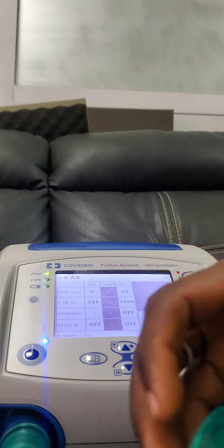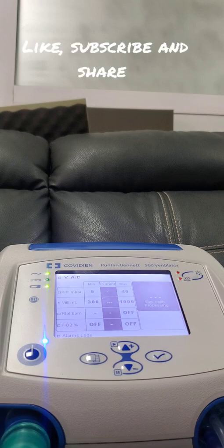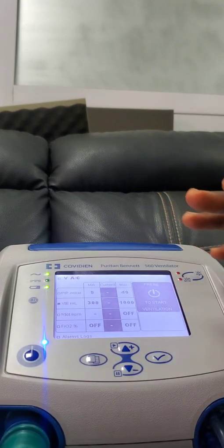I'll take a look at this now. As you can see, it is calibrated successfully. This means that it can now be used on any patients.